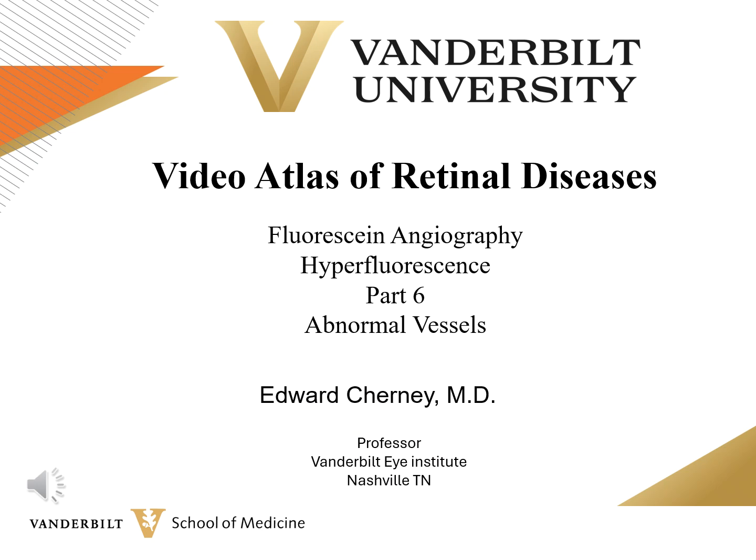The final category of hyperfluorescence to be considered will be hyperfluorescence caused by abnormal blood vessels. These abnormal blood vessels are immature and they do not have tight junctions, and therefore they will leak, and that will cause the hyperfluorescence.